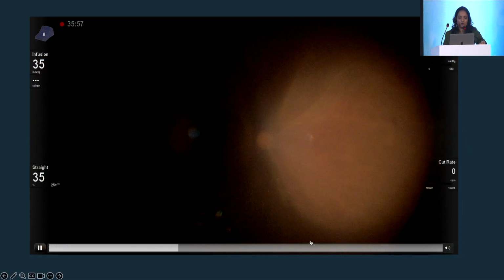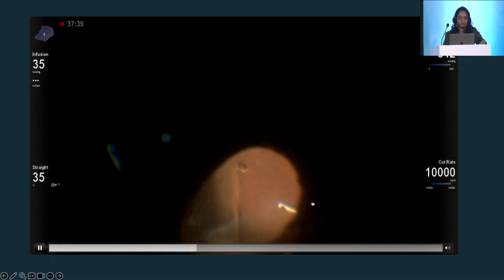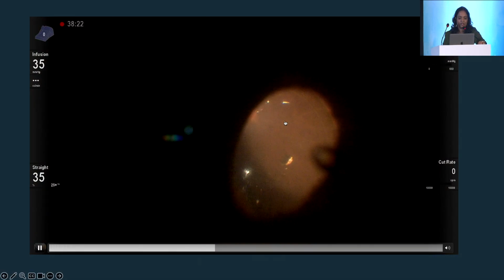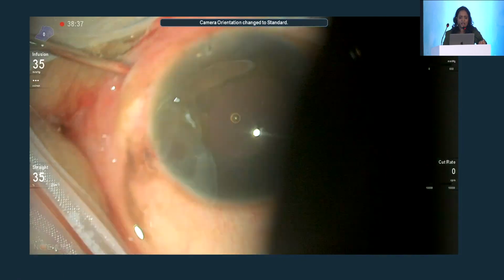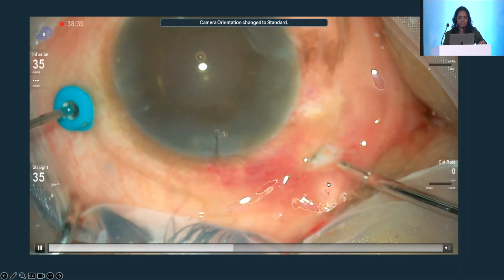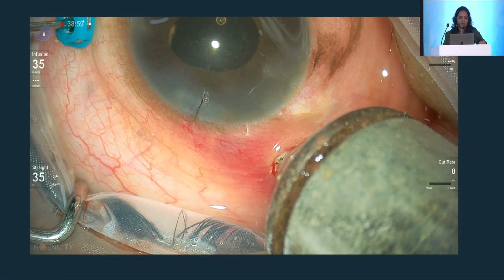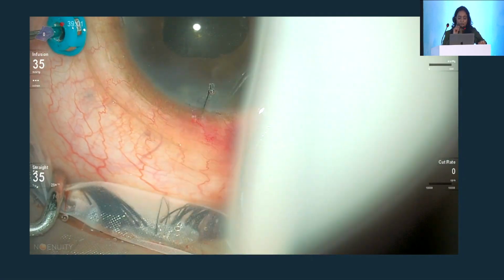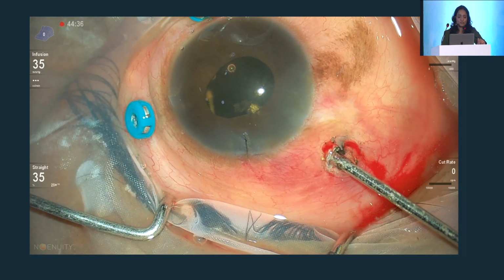And you can see how pale the vessels are. These are all telltale signs of siderosis. These are all toxic effects of the ferric ions. Now, I've placed the PFCL inside, and again I used an intraocular magnet, tried with an external magnet, didn't work. Although I can feel the metal on metal, it's just refusing to come out.